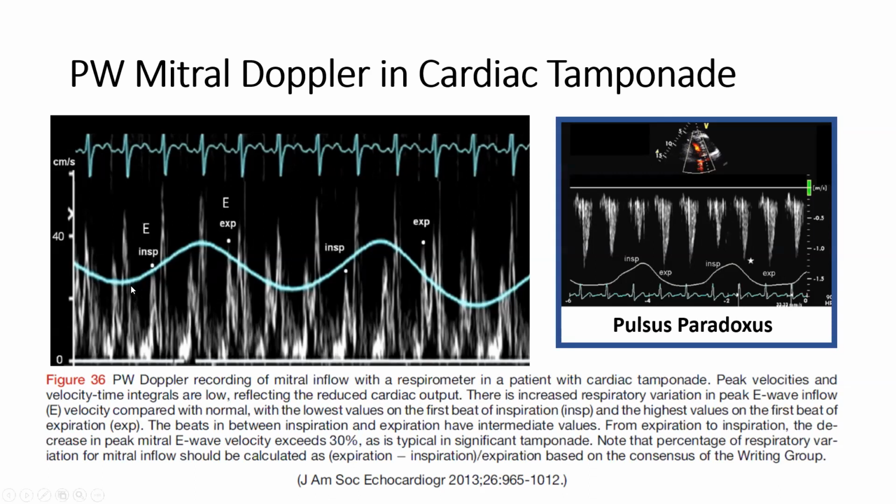So first of all, let me tell you something which may be completely unnecessary, but I think it is sometimes a cause of confusion. The respiratory markers go like this. These are sensors on the front of the chest. So during inspiration, they will always go forward or to the front. And so that'll be expiration, inspiration. So in the exam or in real life, they don't always come labeled like this.